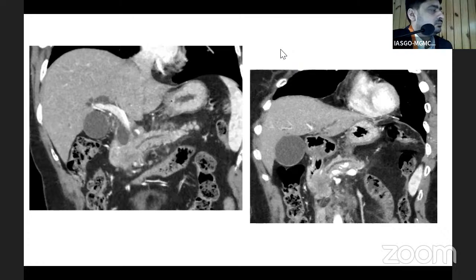In an older patient, like a 70-year-old, when you see dilation with normal LFTs, do a side-viewing scope; I would not take it very seriously. But in a younger patient, it could be worrying, or else follow up closely. One approach would be to do a wide sphincterotomy before you do your cholecystectomy. Again, the patient comes with gallstones and a dilated CBD, I'm assuming. So do a wide sphincterotomy and then follow up, and over the years, if the dilatation persists, you could intervene. I think most endoscopists will also agree that ideally we should drain it and then wait for the subsequent imaging. Yes, sir.